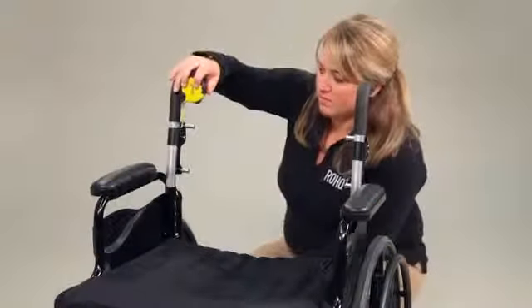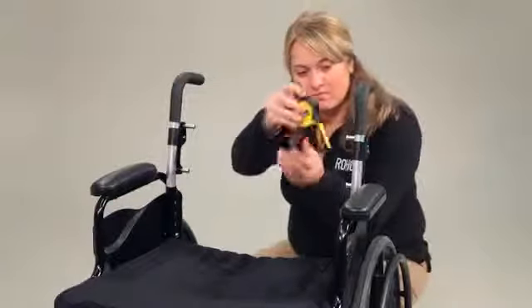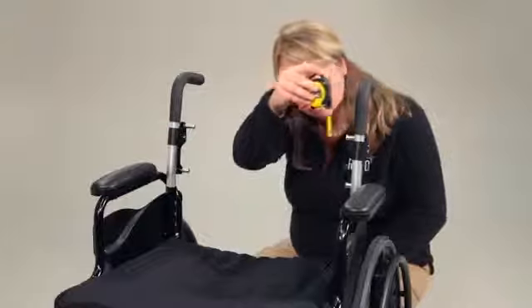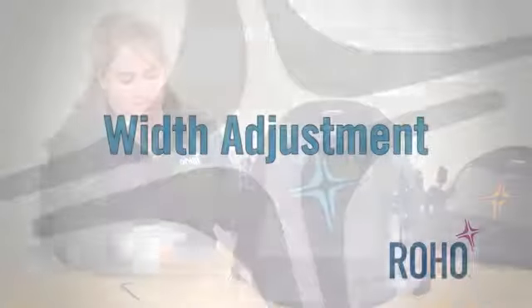Make sure the upper and lower pins of each of the back cane brackets are aligned with each other, both brackets are installed on the correct side, and the height of both brackets are equal. Now, you're ready to adjust the width of the Agility Back System to fit your wheelchair.